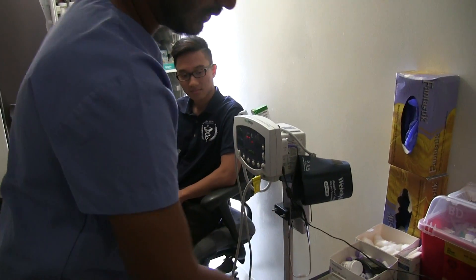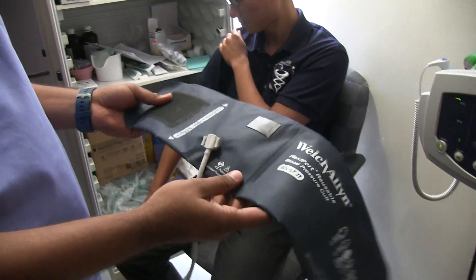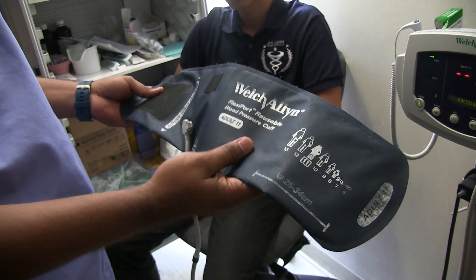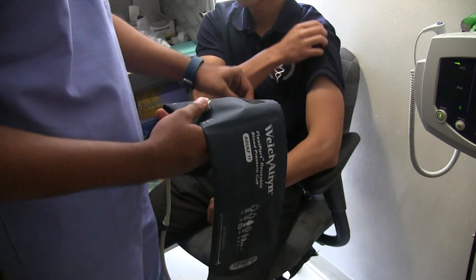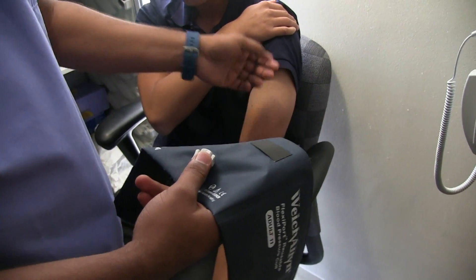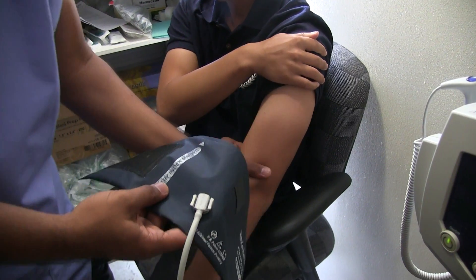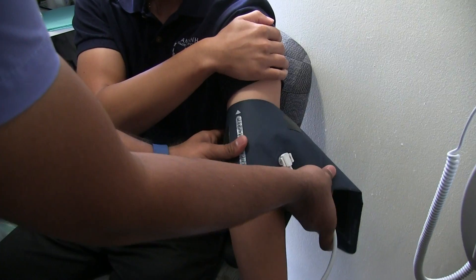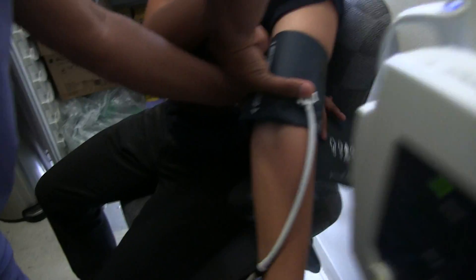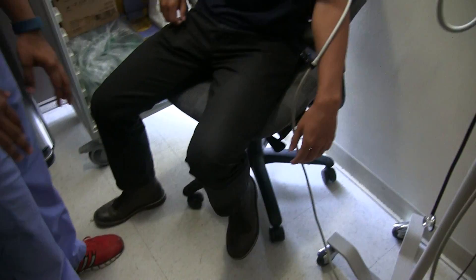First we will take the blood pressure. We have two kinds of cuffs — this cuff works for most patients unless the patient is obese, in which case we use a bigger cuff. Ask the patient to lift their shirt so you can access the skin. Use the artery index marker and place it right on the artery, which you should be able to see or feel. Make sure you close the cuff tightly, let the hand rest, and make sure the patient's feet are flat on the ground.